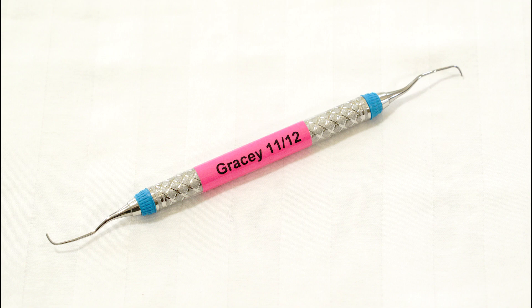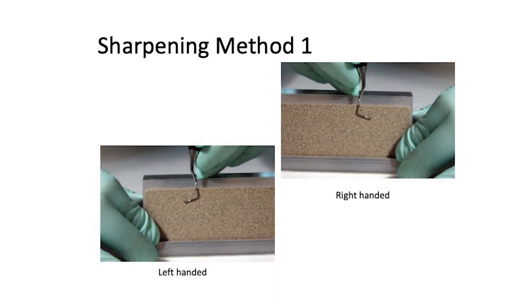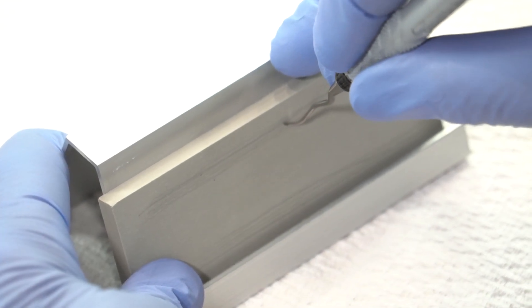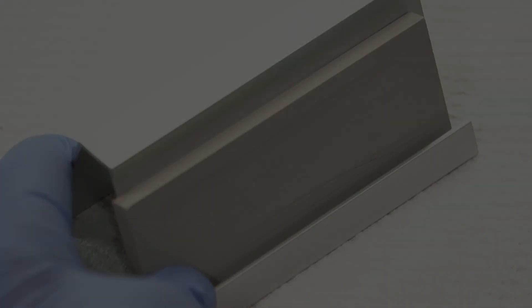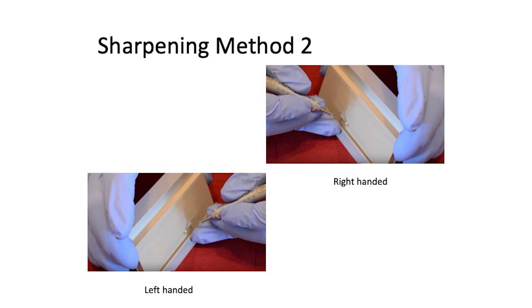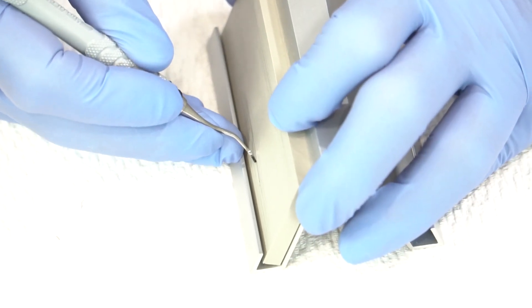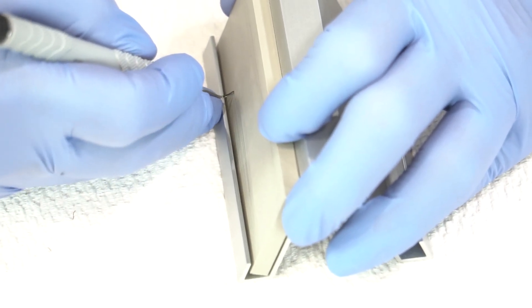For sharpening the 11-12, use method one. Place the heel third with the face parallel to the tabletop, then the heel third, middle third, and roll for the toe third, keeping the face parallel to the tabletop. For the other end and edge, use method two: put the face parallel to the tabletop, starting with the heel third, the middle third, the toe third, and the toe, keeping the face parallel.